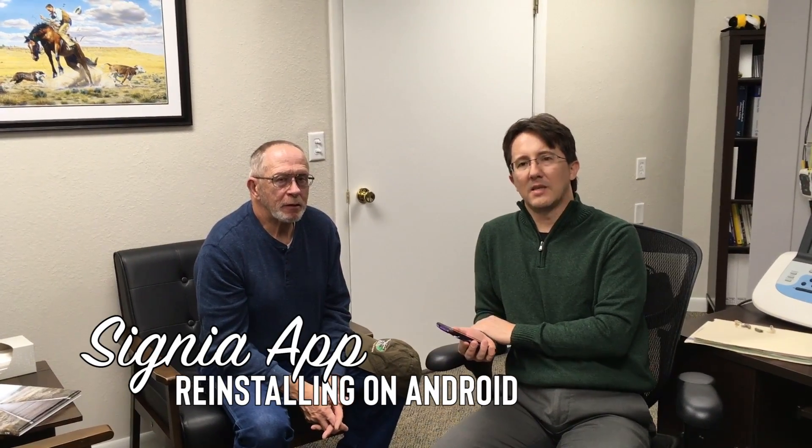We're with Dennis. He is an Android user and he's having some problems with his app. Signia has recently done an update to their app, and some people are having trouble with it. So what we're going to do is delete it, reinstall it, and then pair things all over again. Come on over and have a look.